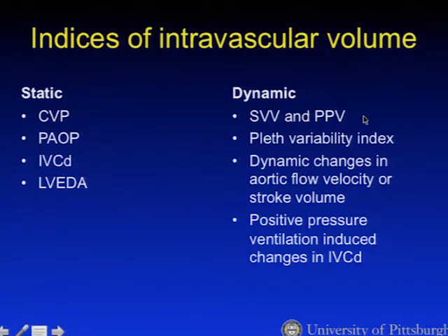In general, these dynamic variables, which rely on the principle of phasic changes resulting from positive pressure ventilation because of ventricular interdependence, these turn out to be better predictors of fluid responsiveness. So we'll discuss that principle briefly.